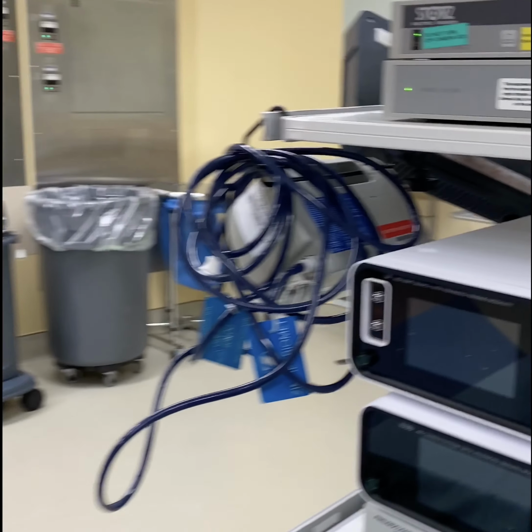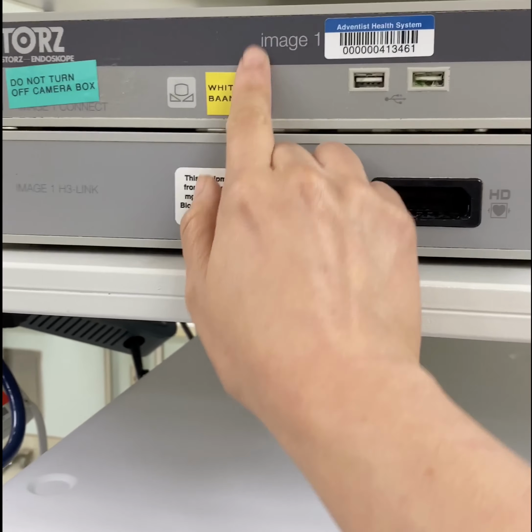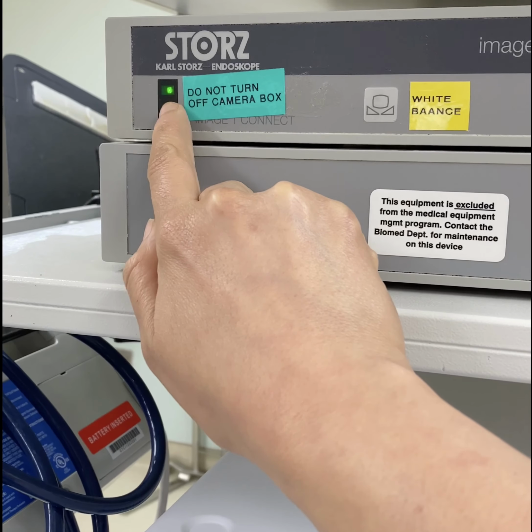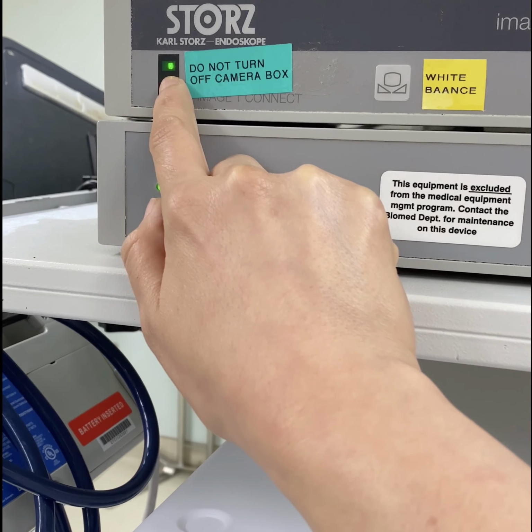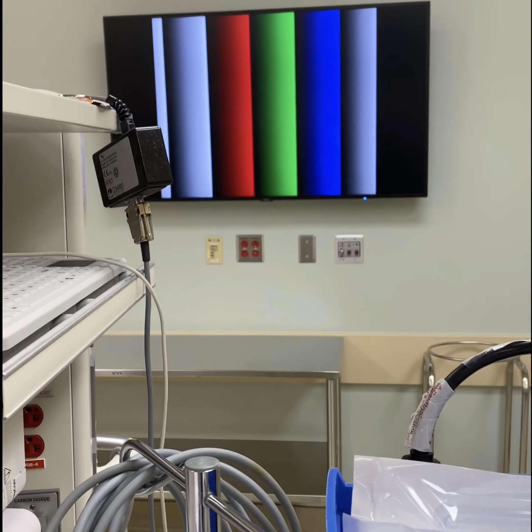The second step is you're going to walk over to the boom. You're going to look for the box that says image 1, and you're actually going to turn it off. I know it says do not turn off camera box, but you're actually going to turn it off. Okay? You can see you have color bars after you turn it off.